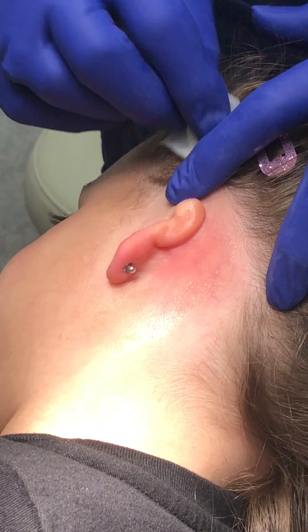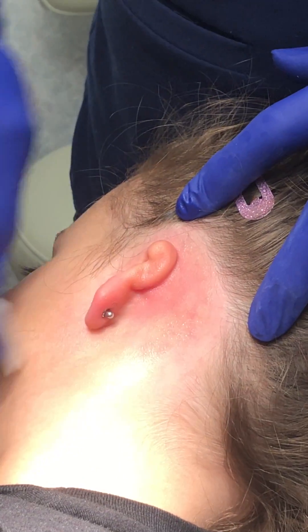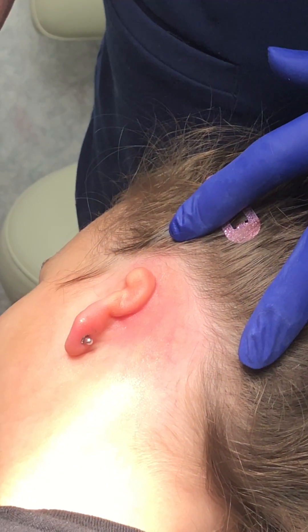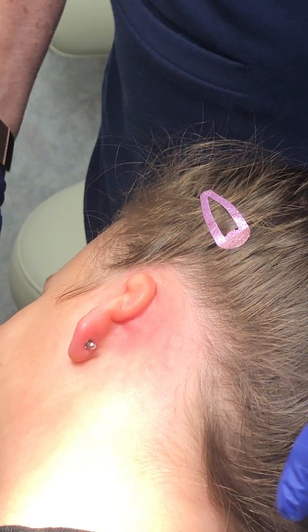And off to the races we go with S. You see the hair is in the way — we're going to move that out of the way so we don't glue the ear to her hair. Now we're just going to let it dry. Stay like that, sweet girl. And that's the end of this video.